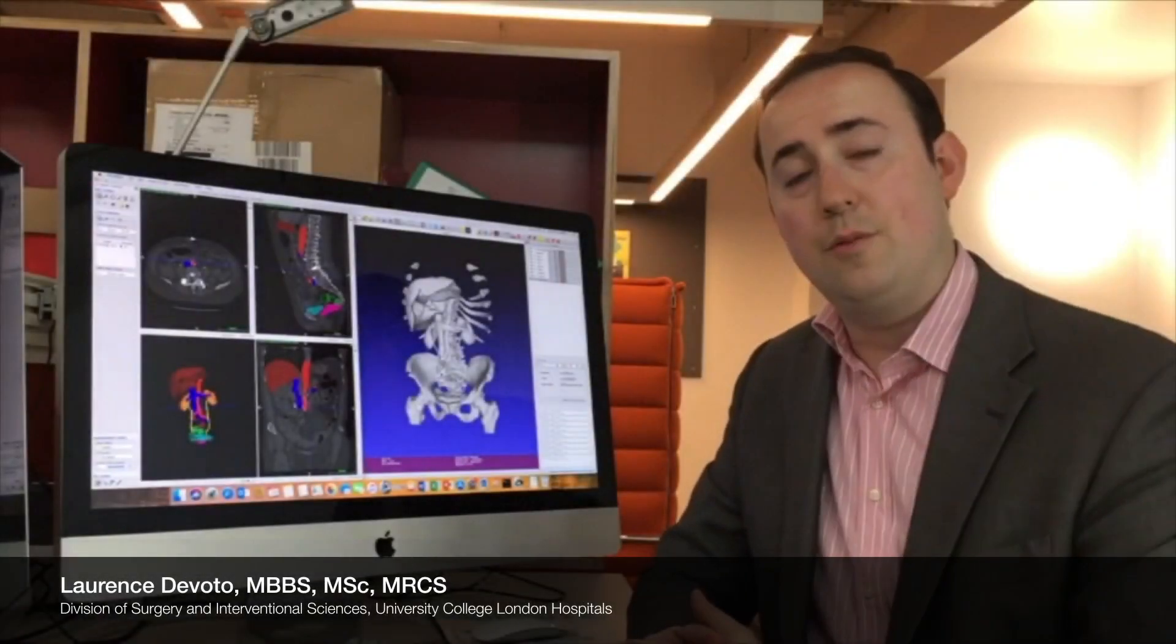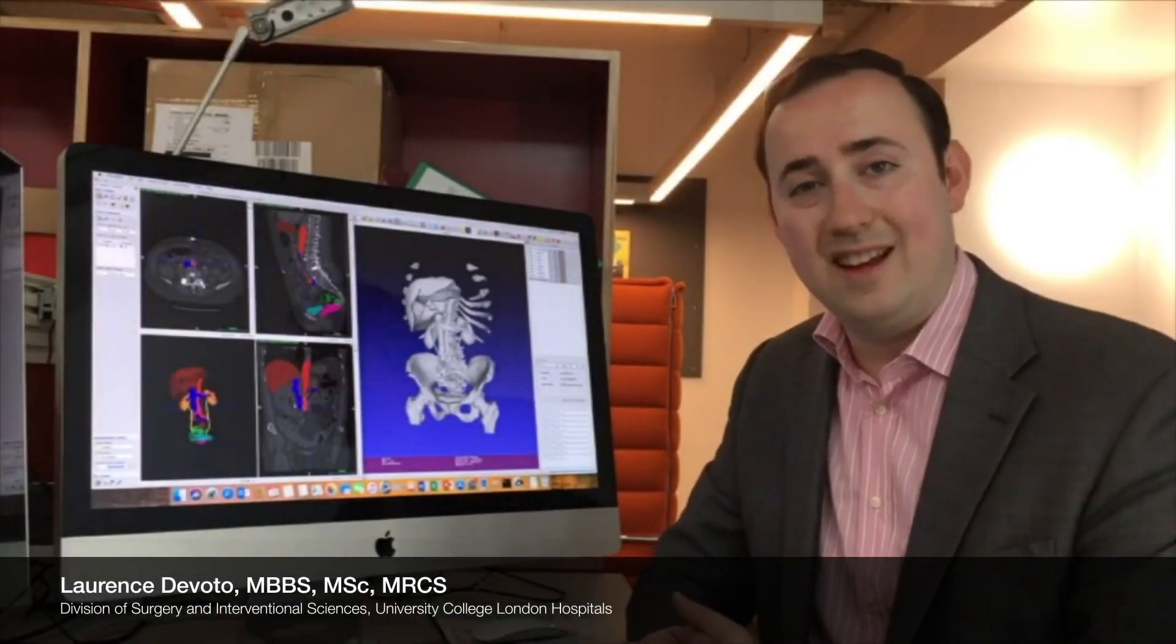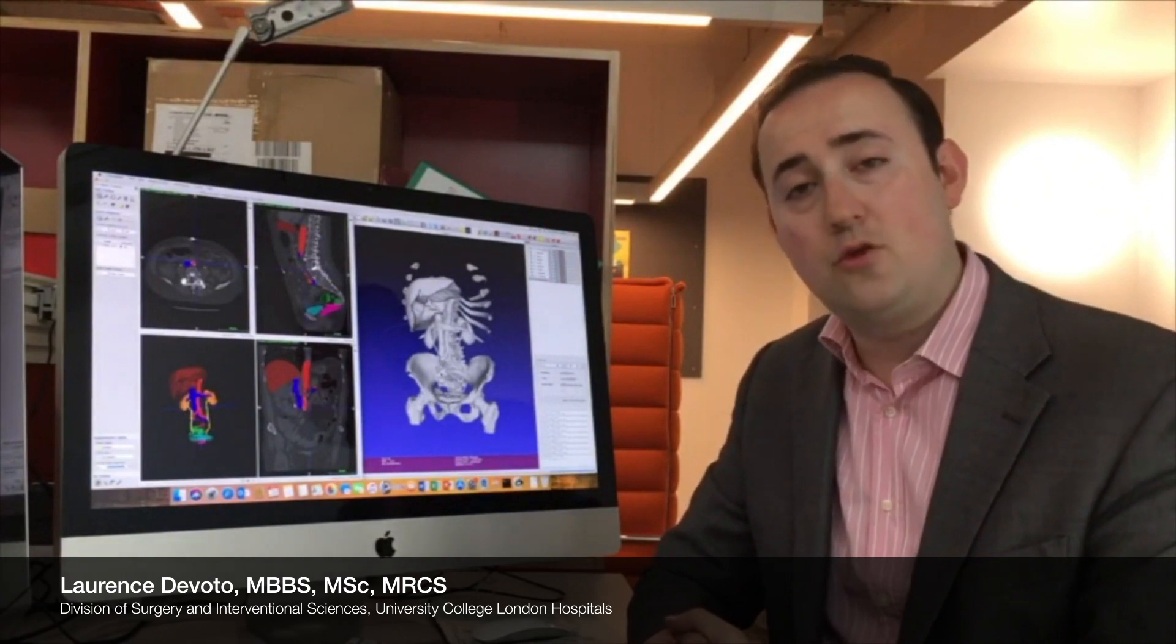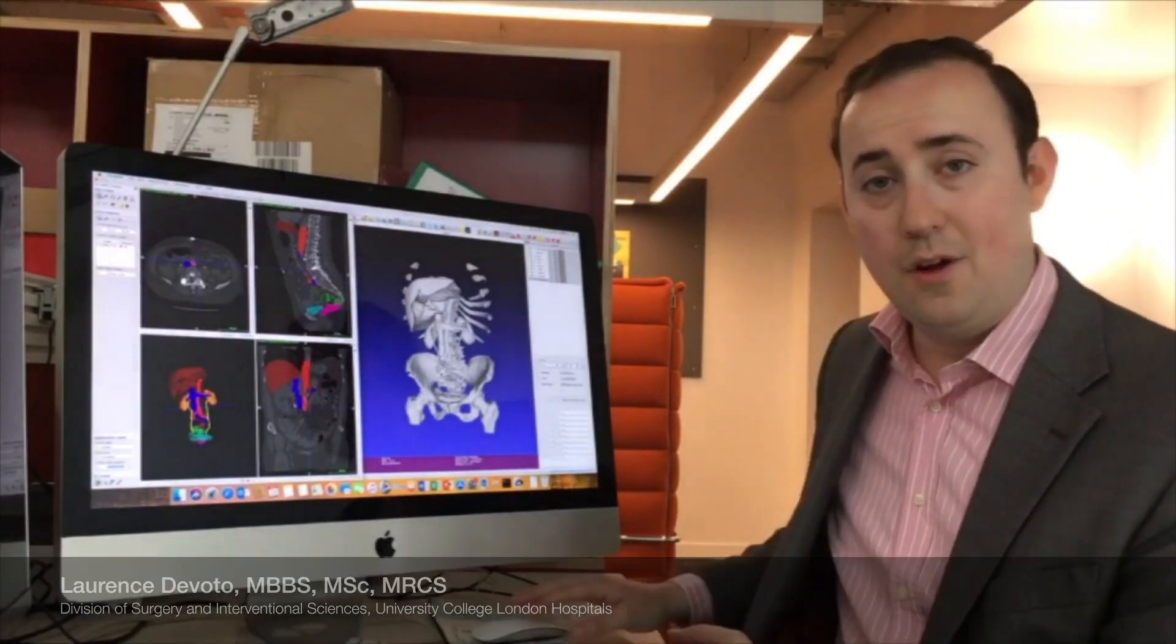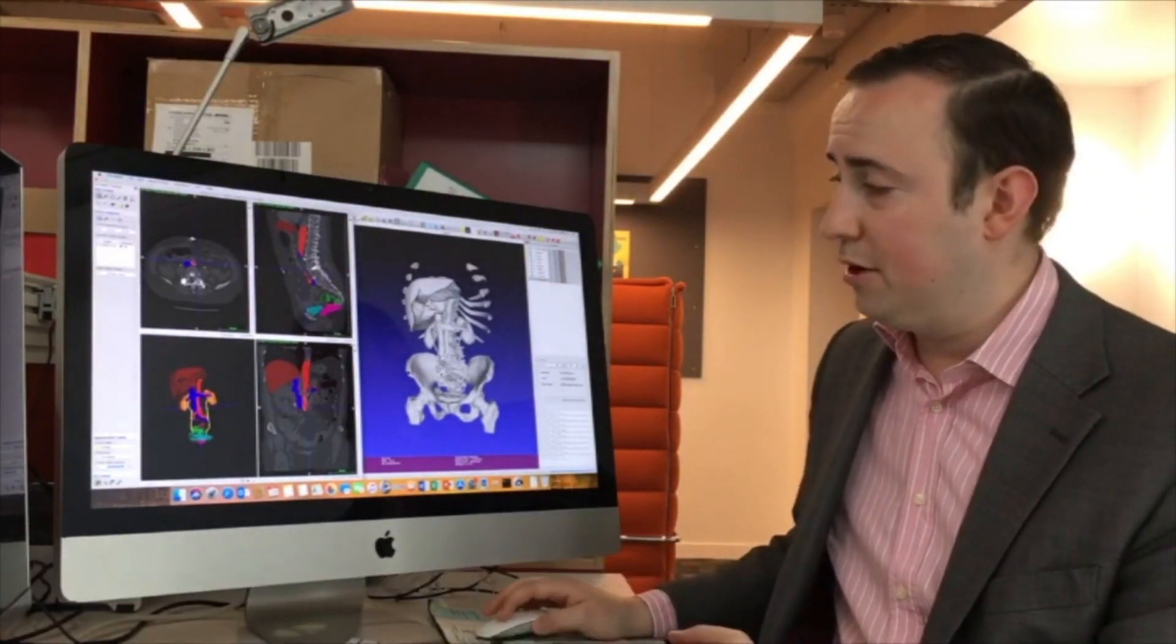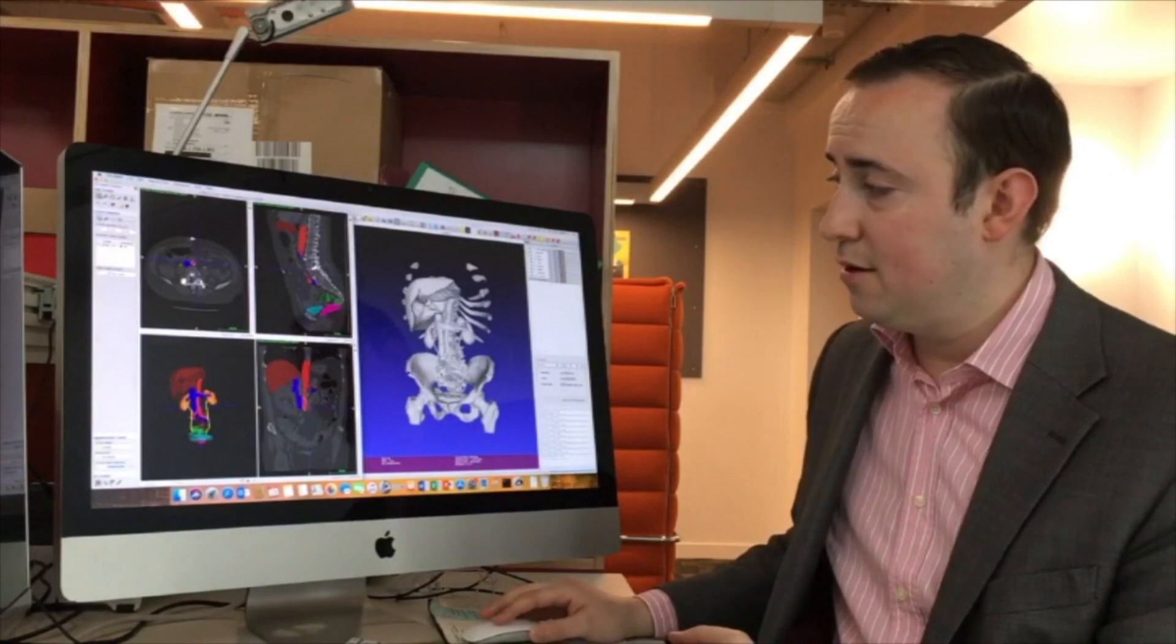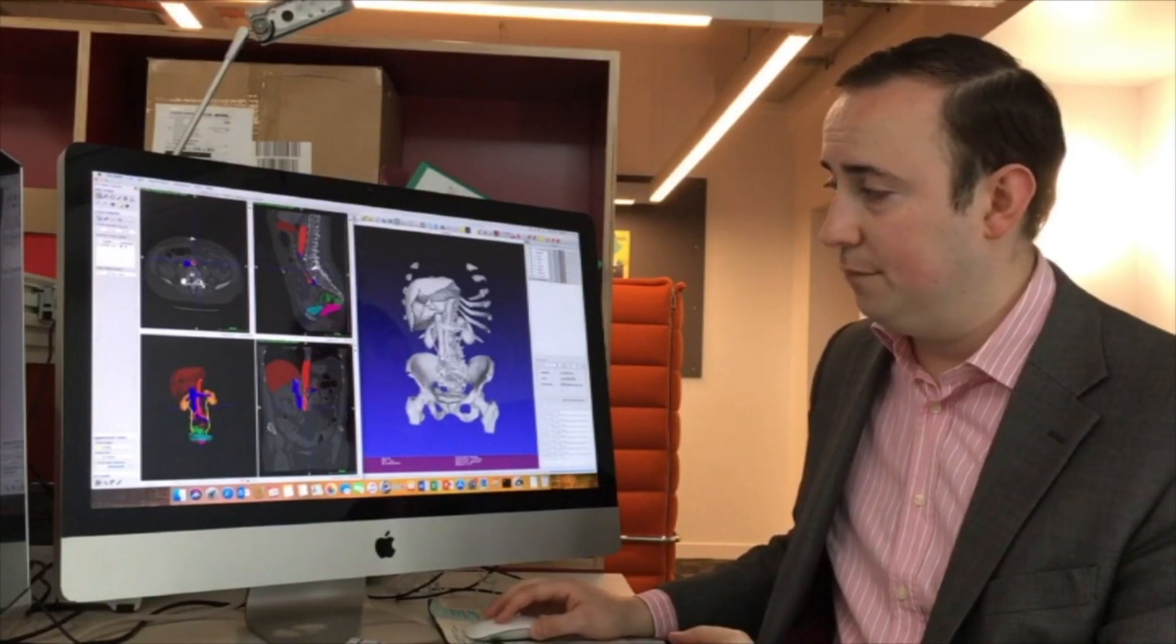To create this model, we must first select each structure in turn and manually draw around the outline through every slice that we expect to find in the CT scan.